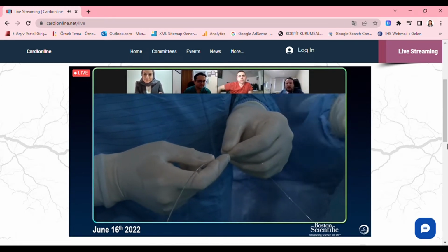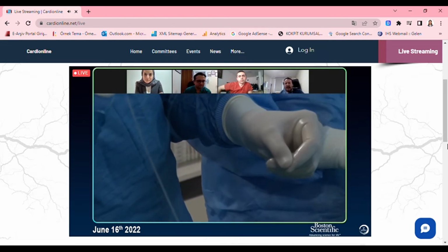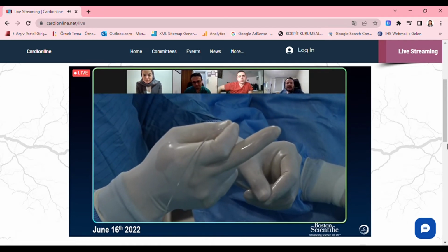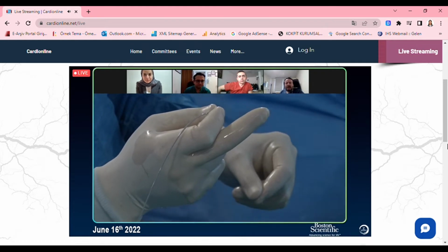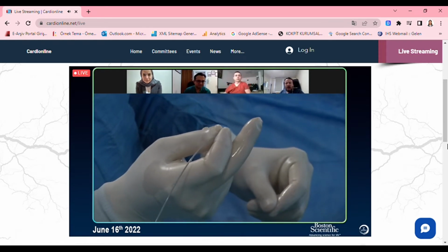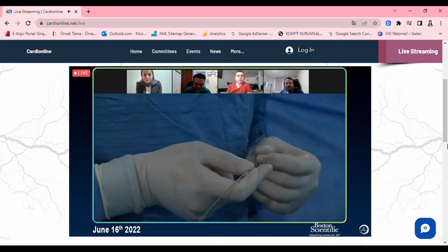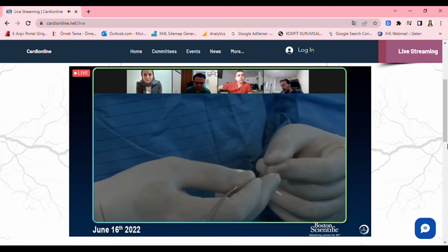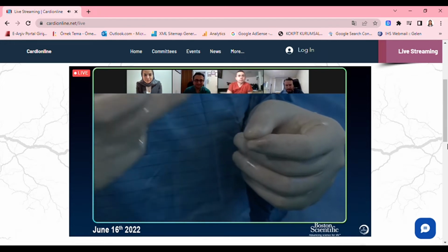And propofol, just 2 to 3 cc in the back, and we should also be sure that the fluid is dripping very fast, because if you don't have the fluid dripping very fast, the wire gets stuck on the rotabur. So we should check that, and I have learned that from Esad. Thank you for that, Esad. Propofol would be a good solution. All right, I didn't use it.